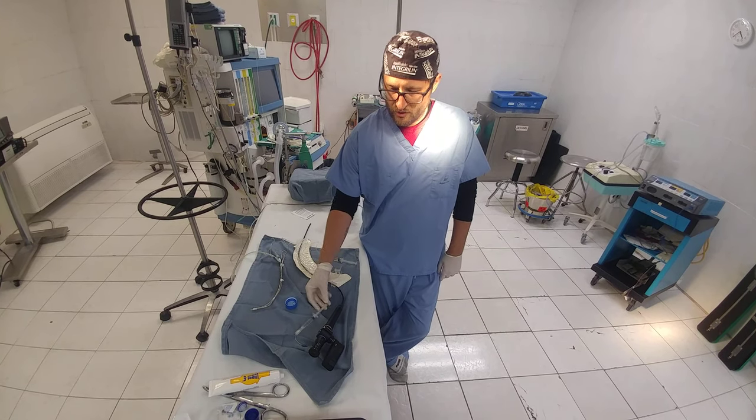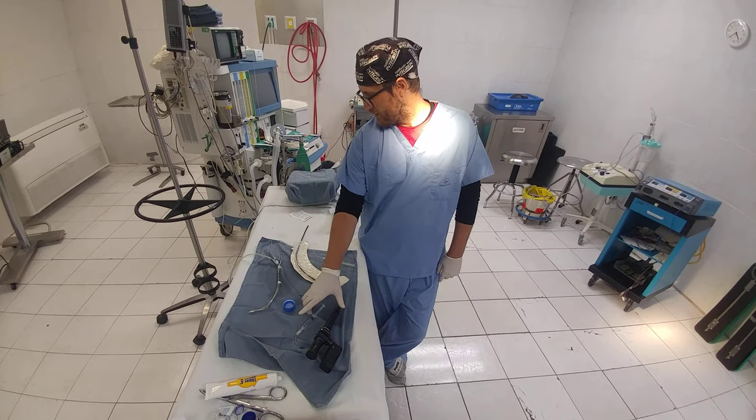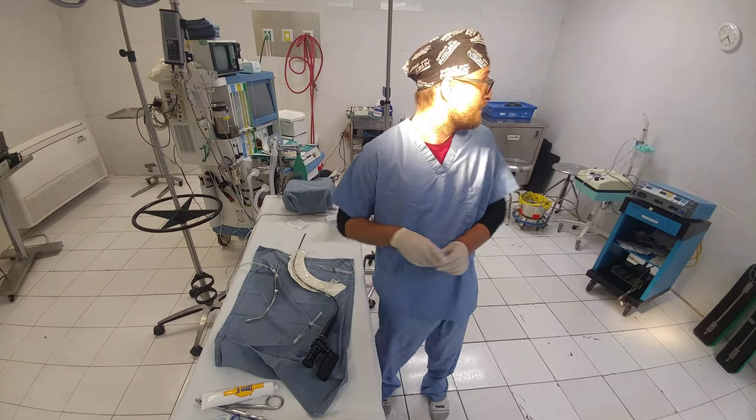If I need to, I have an epidural catheter here with some 5% lidocaine attached to it that I can spray the cords or whatever if I have to. So let's go and give it a start and see how long it takes us.